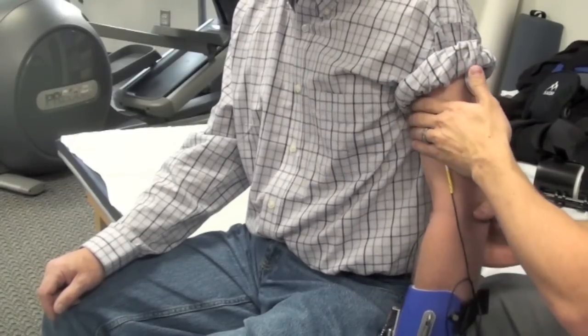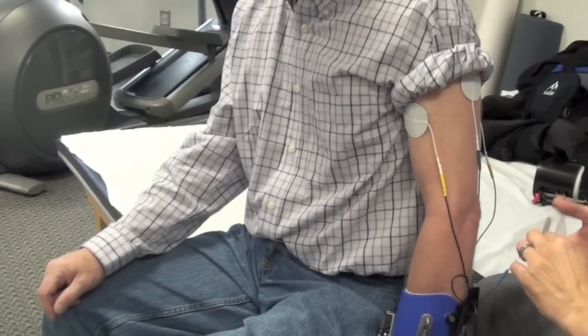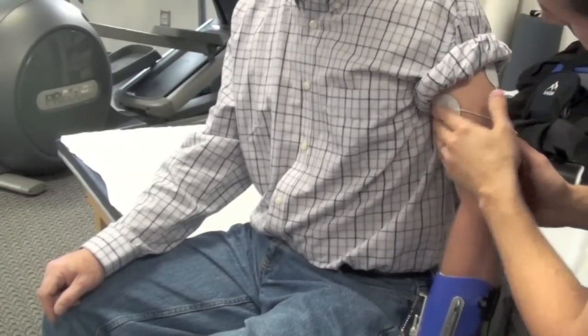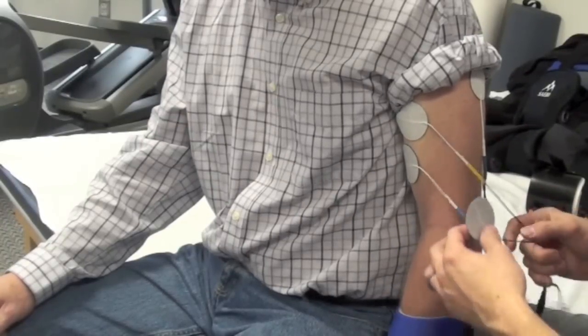As a reminder, with EMG, you're going to have three EMG electrodes for the biceps. You'll have a yellow and a blue, which can be either proximal or distal, and you'll have a black electrode, which is a ground or reference, that can be placed anywhere on the arm.